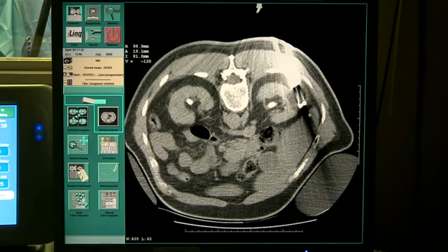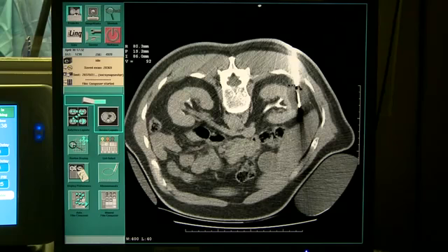We've got liver here, but it's going to be safe. The ice only goes forward about 5 millimeters. And here, with less metal artifact, we can see the extent of the ice again, starting to incur into the kidney. Now, realize that the lethal zone is 3 to 5 millimeters inside. Nice thing about cryo, again, is this interface right here is just ice. It's not lethal, it's 0 degrees. 3 to 5 millimeters inside that is minus 20, and for kidney, that's lethal.